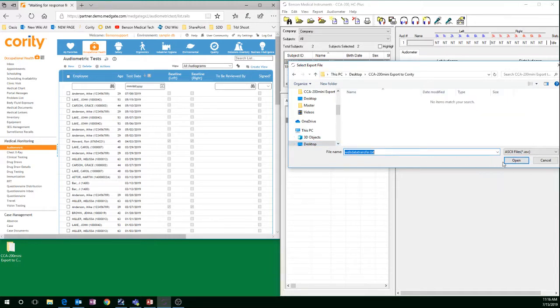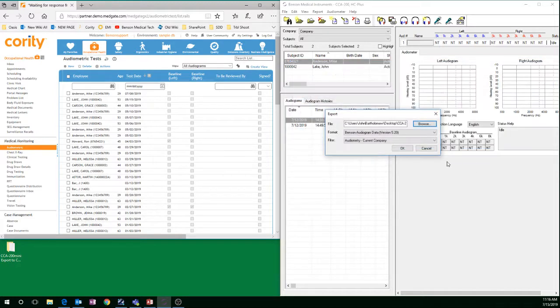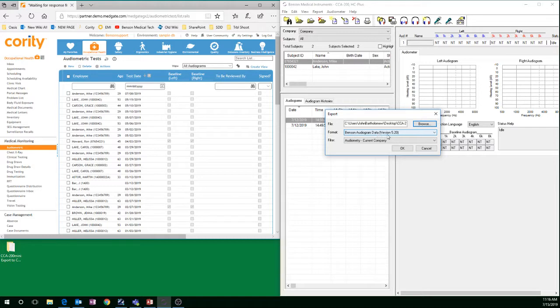I clicked Open. For Format, Benson Audiogram Data version 5.20 is what you want to select. And Filter, Audiometry, Current Company.